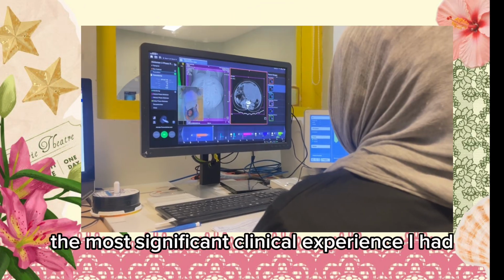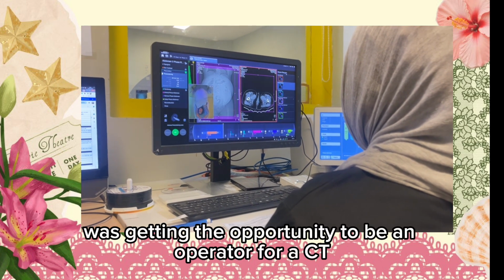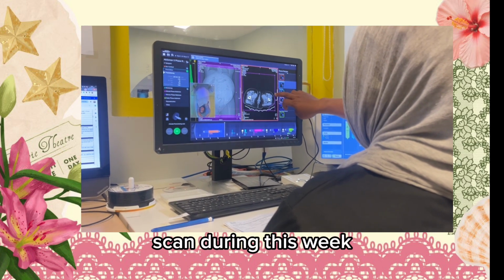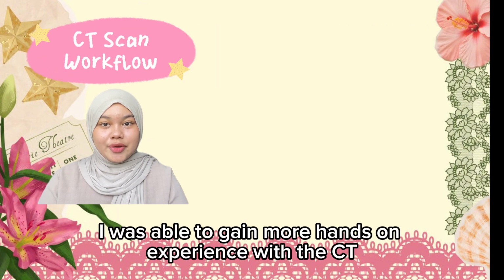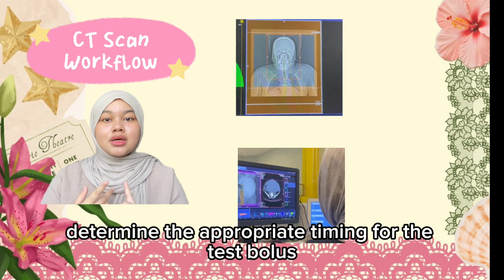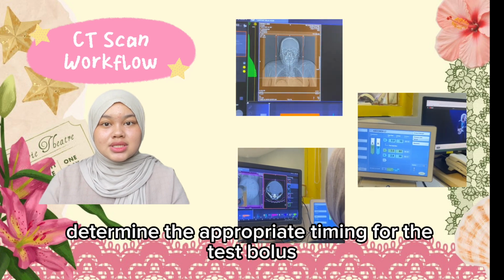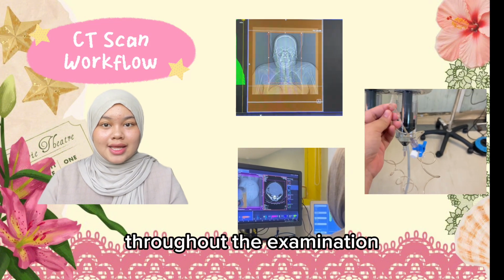For this week, the most significant clinical experience I had was getting the opportunity to be an operator for a CT scan. During this week, I was able to gain more hands-on experience with the CT workflow. I learned how to perform the topogram, determine the appropriate timing for the test bolus, prepare and administer contrast, and communicate with the patient throughout the examination.